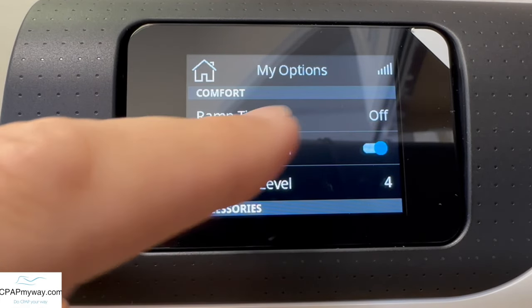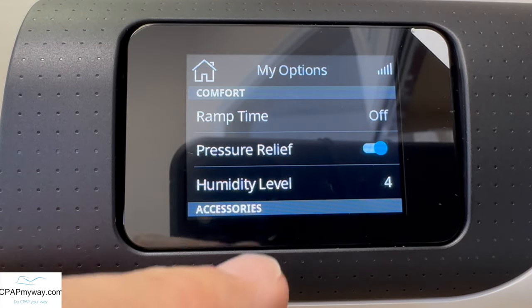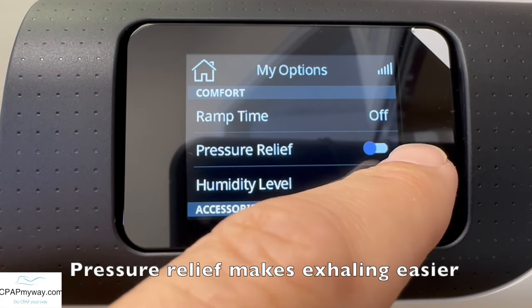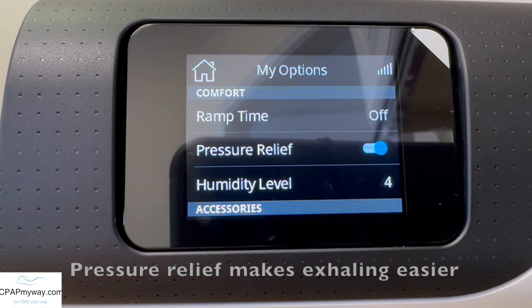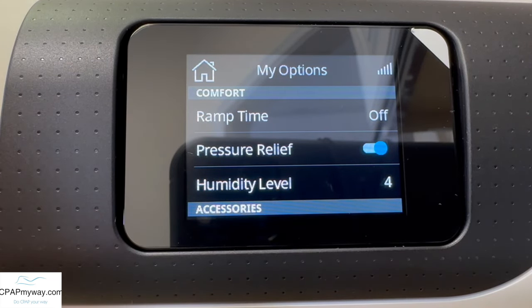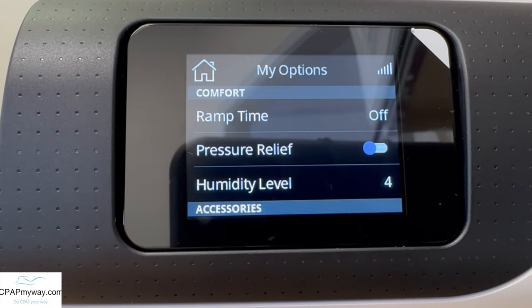Once you make the change, hit okay, and you'll notice that the change takes effect on the settings. Pressure relief is the EPR setting, so you can turn that on or off. If you've got it on and it's blue, it will give you the exhalation relief, which is EPR. It makes exhaling a little bit easier on CPAP. If you want a nice steady pressure and you don't like that exhalation relief, you can turn that off.